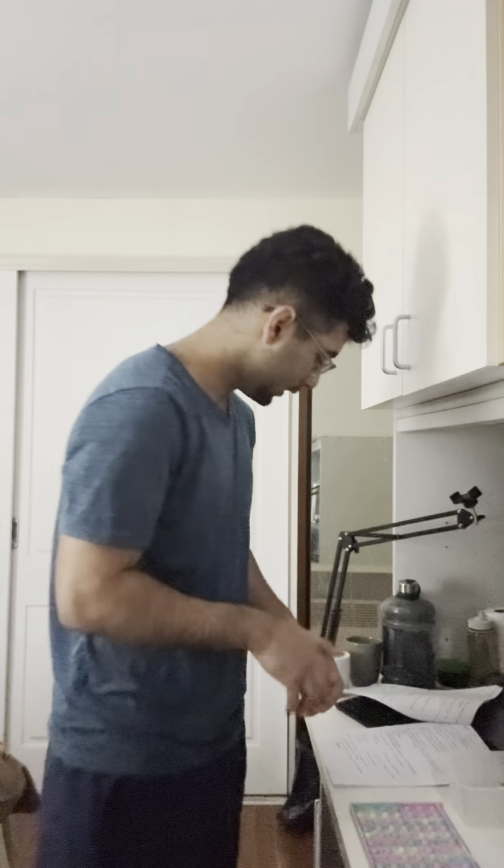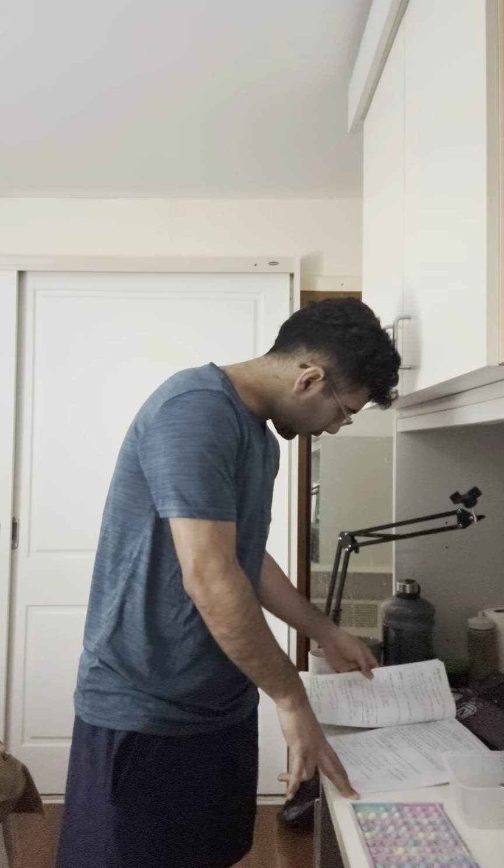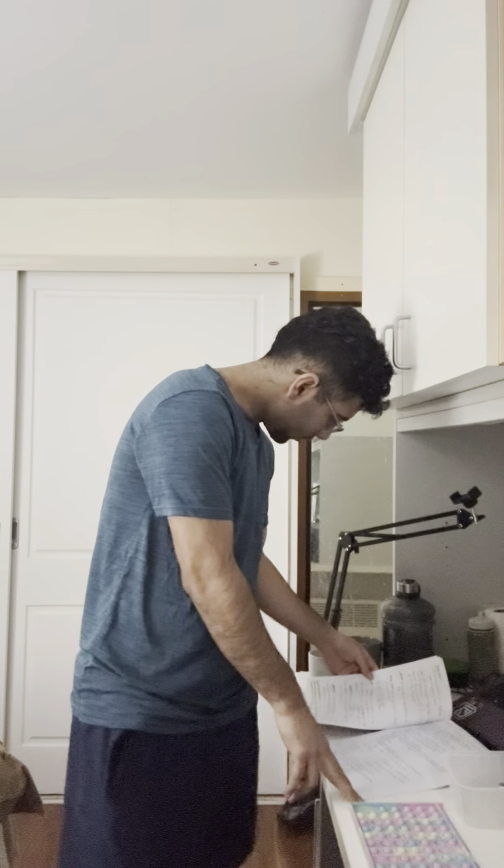The third check is basically you go to the patient's bedside where the patient lies. Hi Jane, I'm back again. How are you now? All right, she's all right. Are you ready for that subcutaneous injection? What are the sites that subcutaneous goes on? It goes in the belly, normally in the belly, just under your deltoids. Basically your subcutaneous goes in the fatty tissue, because it goes under the layer of skin, right? So that's why you need to understand what the sites are that we normally go with.